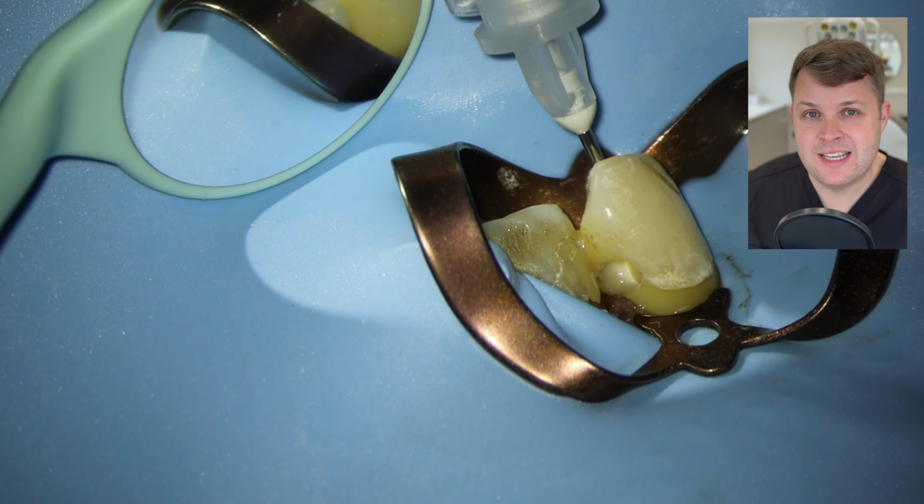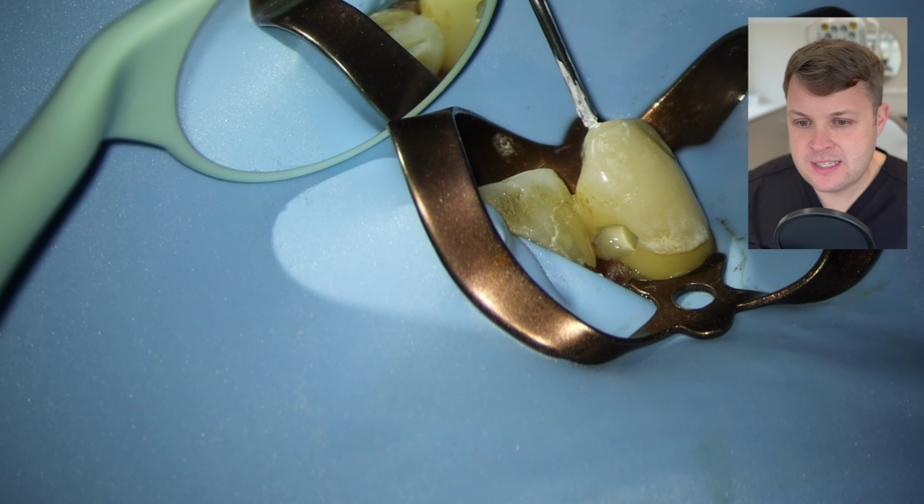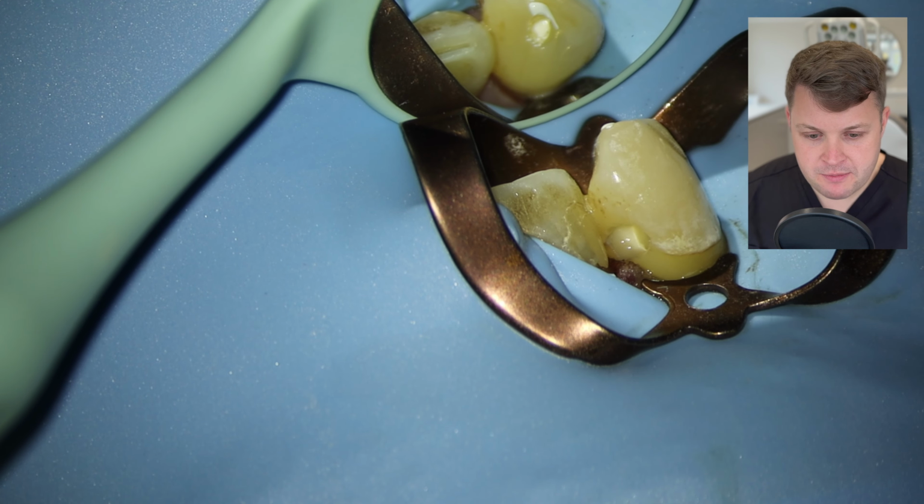And then I'm just going to put it on my hand just to feel how much I need to be pushing down, and then I'm going to go back in, and I'm going to make sure that I am filling the whole canal space with our bioceramic and getting it to almost nearly the working length, maybe 5 millimeters from the working length. And once we've backfilled, we can see that the canal space is nice and filled.